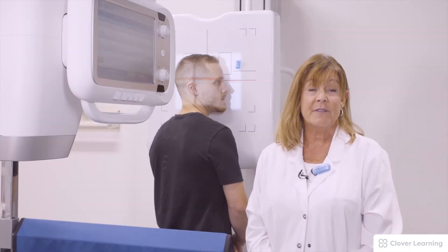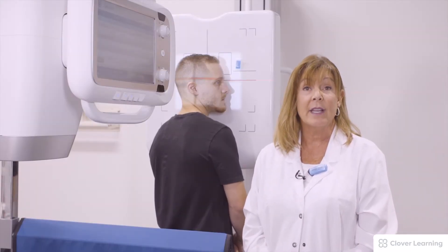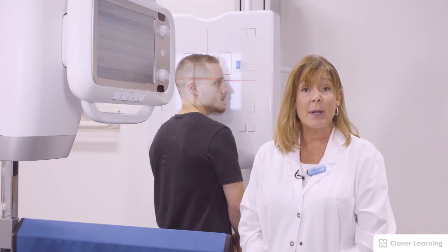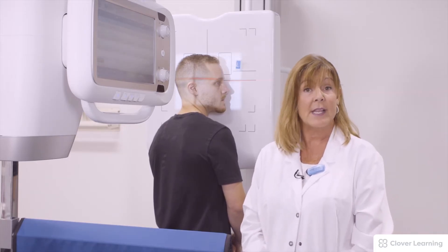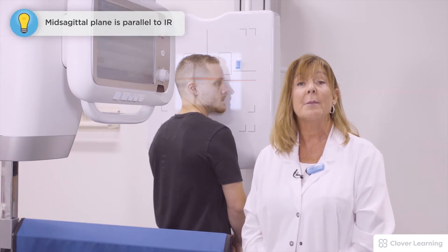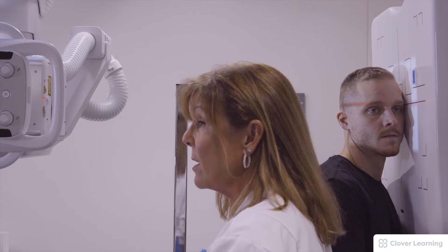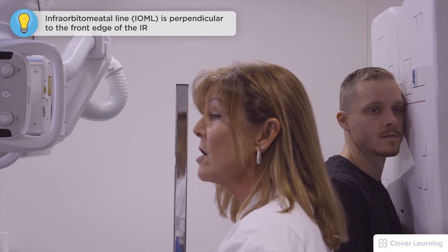For lateral projections of the skull it is recommended that right and left are done. I have my patient standing at the upright bucky with the left side of his head closest to the IR. This places the mid sagittal plane parallel to the IR. The IOML is perpendicular to the front edge of the IR.